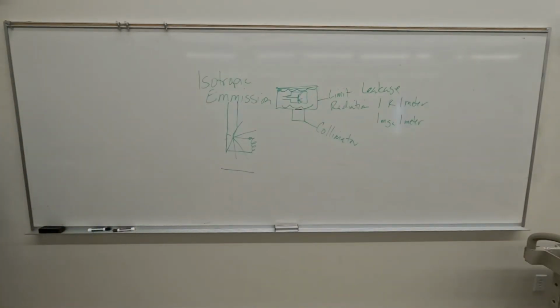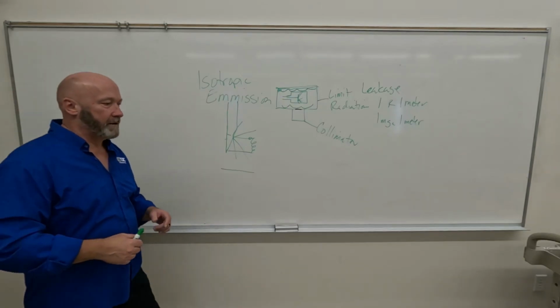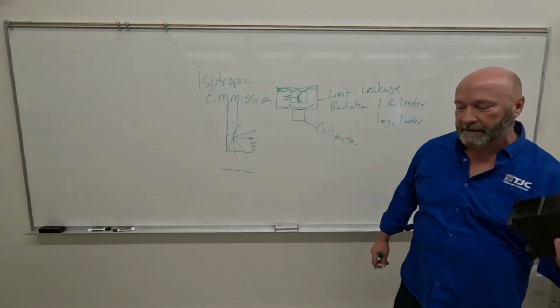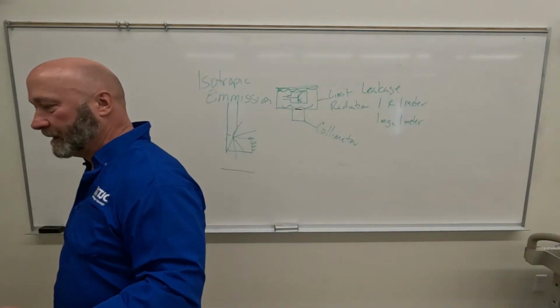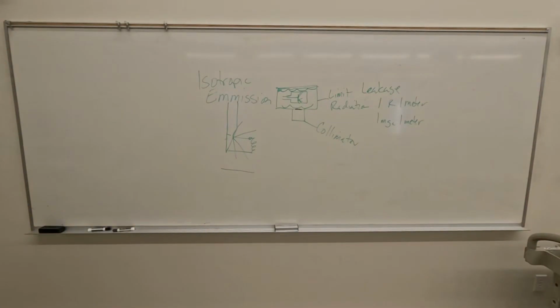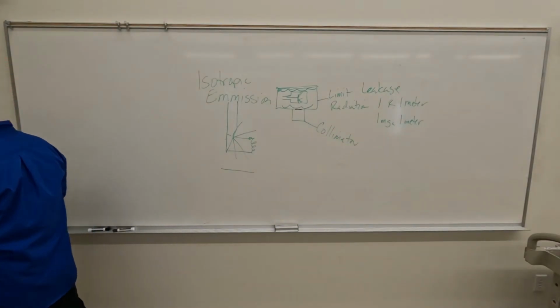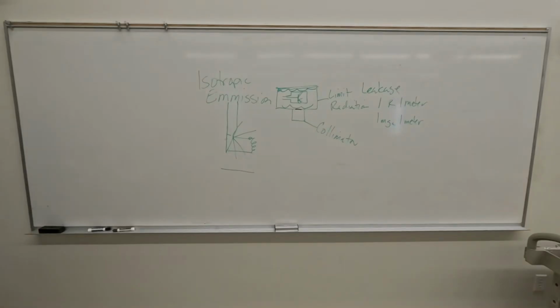Okay, so now that that's gone most of the way around, I'm going to go ahead and start this. This is kind of heavy too, but this is not going to explode if you hit the ground with it. But again, take a look at the difference in the filaments. Watch your toes. Look at the difference in filaments, and hopefully it will make a little more sense.